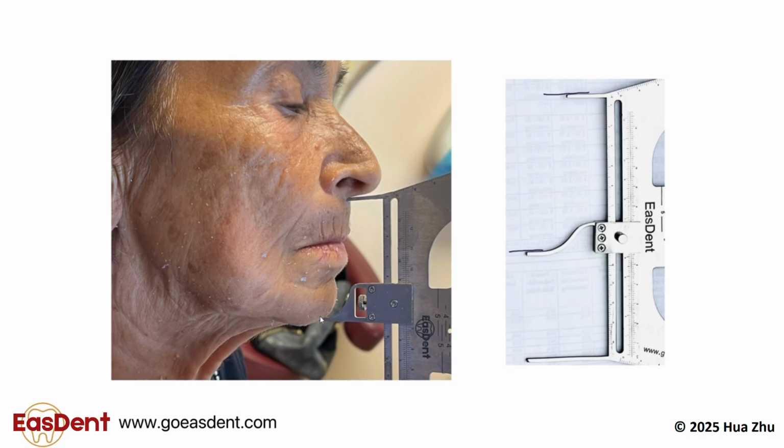If your final impression material is thick, it will raise the VDO a little bit. A thick final impression happens a lot, especially for beginners. Your final impression thickness may not raise the VDO exactly 2 mm. You can measure what VDO you get after your final impression and let the lab increase or decrease the VDO to what you want.